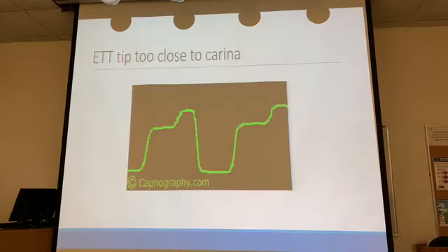So I'm gonna go through a couple of them. And these are just, you know, weird ones that you might come across, but this is an example of, let's say you intubate somebody or somebody's intubated at a facility, you pick them up, and you're seeing this kind of waveform when you hook them up. Most ERs don't even have capnography. Is there any ERs that you guys have been in where they had a waveform going? Some have the ability to get it for maybe a single monitor, but it's not set up all the time. But there's not very many.